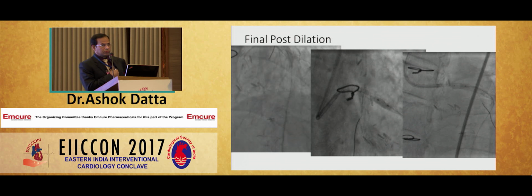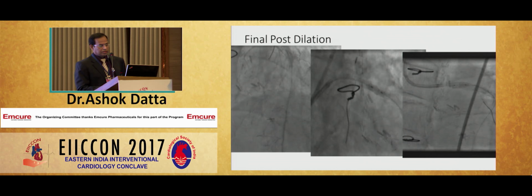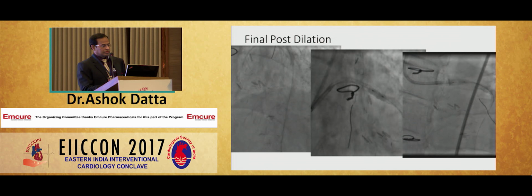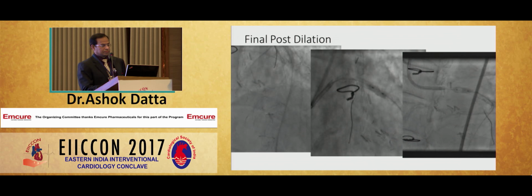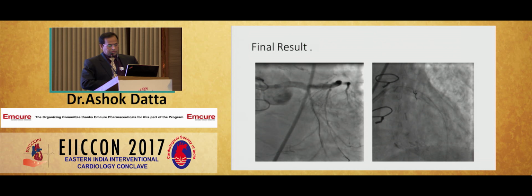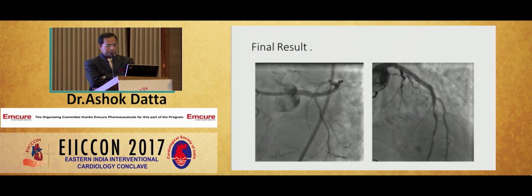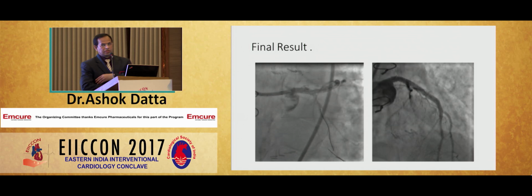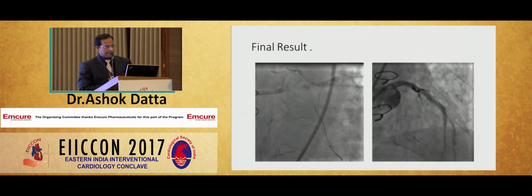So this is the final post dilatation with a 4.5 millimeter NC balloon in the left main. So this is the final result. That was done in 2015. Till now the patient is doing well and regularly followed up.